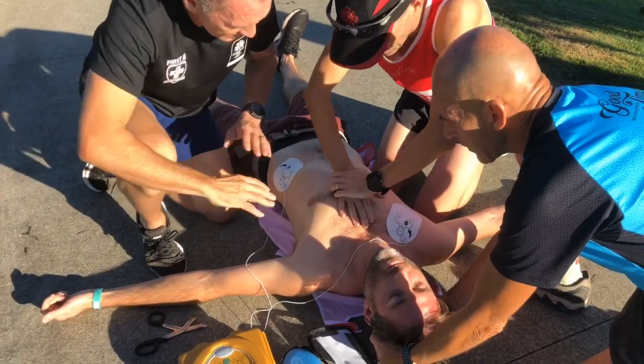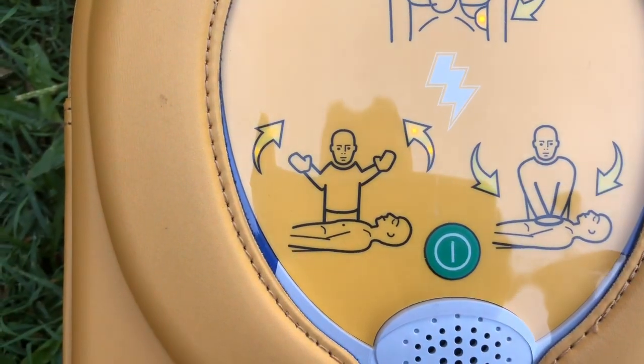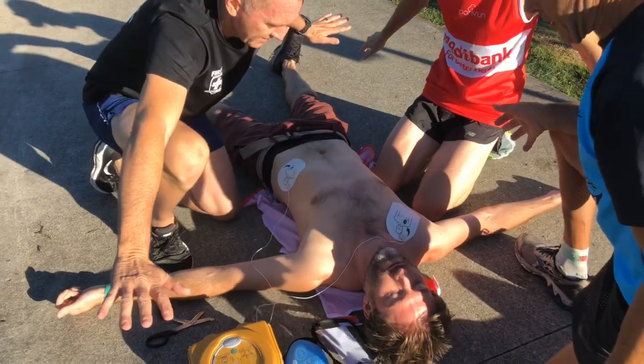The device will begin assessing the heart rhythm. Do not touch the patient while it is analyzing.